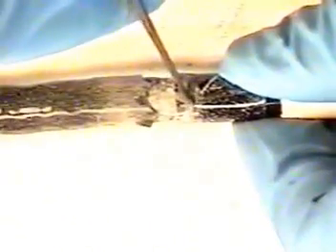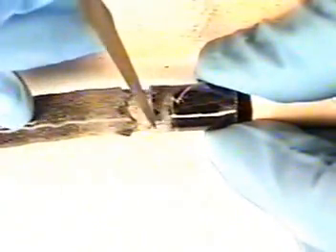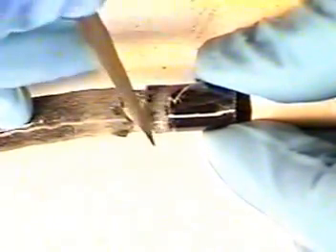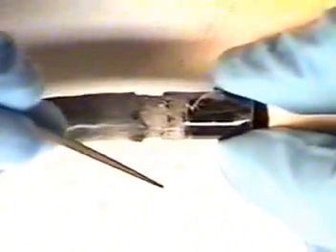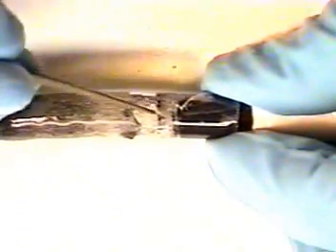File the glue all the way up until you meet the Scotch tape mark. Again, be careful not to file down into the insertion tube. If you do, you will cut into the bindings, which will cause threads to pop up, which will make it difficult when it's time to re-glue the bending rubber sheath.